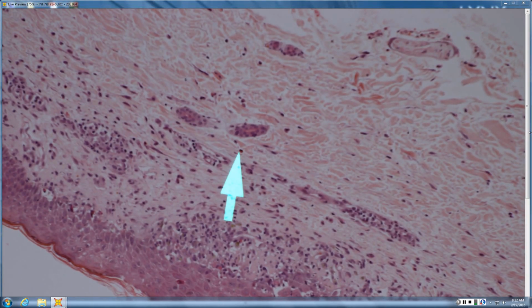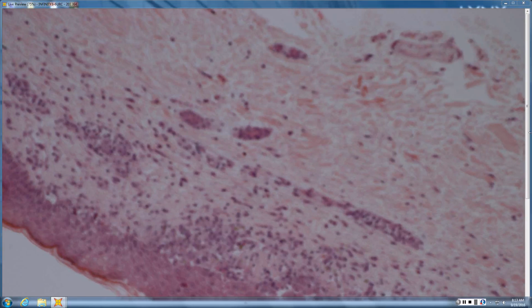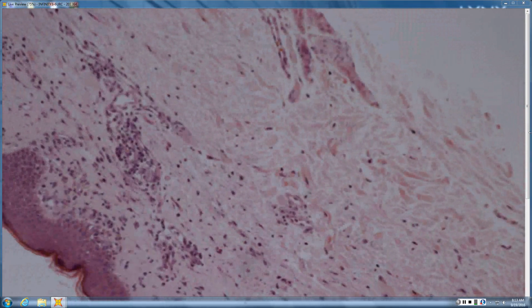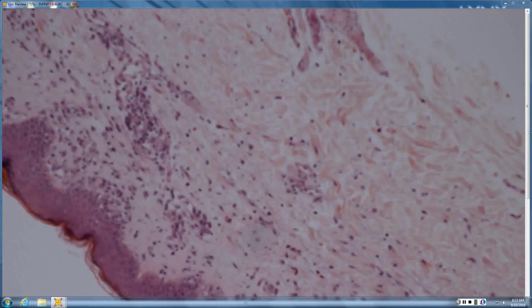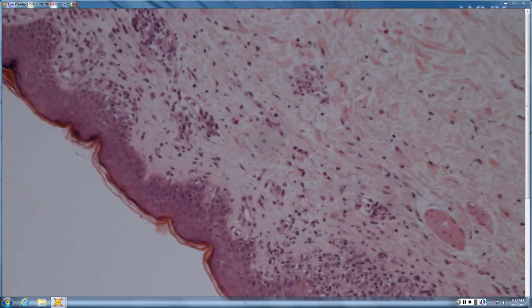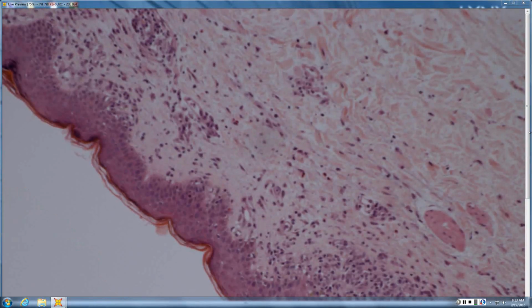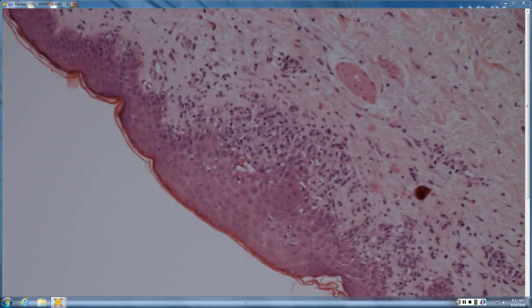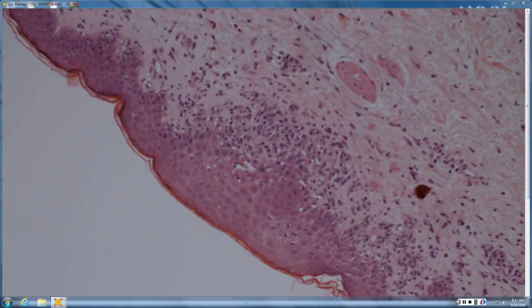There's some eosinophils as well. Nicely pointed out, thank you. And there's necrotic keratinocytes up there I saw as well on the other spot. So you'd favor lichenoid drug reaction in this. Yeah, this would not be bad for an evolving lichenoid drug, kind of subacute process, eosinophils present.